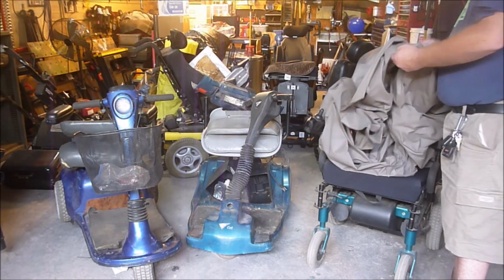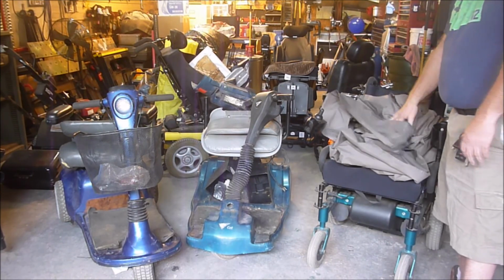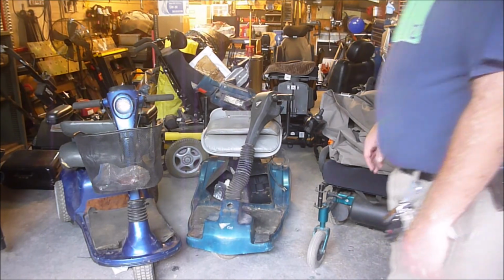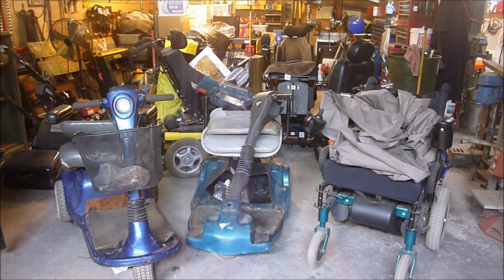Something else you'll notice in this one, there's a cover here. I actually picked barbecue covers up from the hardware store. Those work really well for rainproof and that kind of stuff. So if I'm traveling and I put my wheelchair on the back of a car, because I have, I'll show that, I have a video on that actually, how I got a low buck wheelchair lift that I can put in the hitch of my rig. I have a video on that, so go check that one out too.